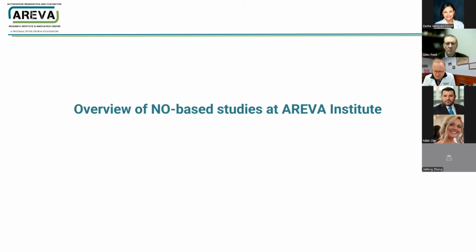Somebody posted in the chat whether it's applicable to ARDS, what we've seen so far. We need to be clear about the blood flows. The data you will see will be applicable to about 1 liter to 1.5 liter blood flow. The data that you will see will be applicable exclusively to veno-venous conditions. I do agree that some of this can be extrapolated, but considering that many applications are used with a variety of different devices, a variety of different settings, cardiac and more invasive centers, we need to be very specific about what our data relates to.